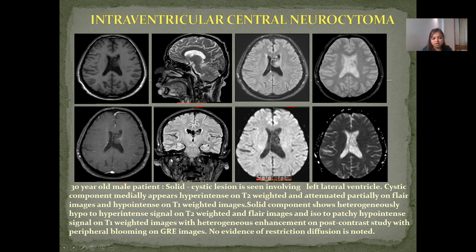Case 4 — Intraventricular Central Neurocytoma: 30-year-old male patient with a solid cystic lesion involving the left lateral ventricle. The cystic component appears hyperintense on T2-weighted images, partly attenuated on FLAIR, and hypointense on T1-weighted images. Solid components show heterogeneous hypo-to-hyperintense signal on T2 and FLAIR images and iso-to-mildly hypointense on T1-weighted images with heterogeneous enhancement on post-contrast and peripheral blooming on GRE. No diffusion restriction is noted.